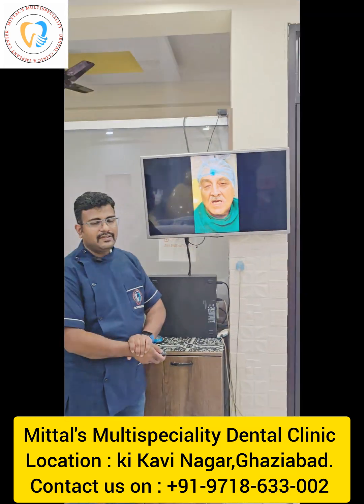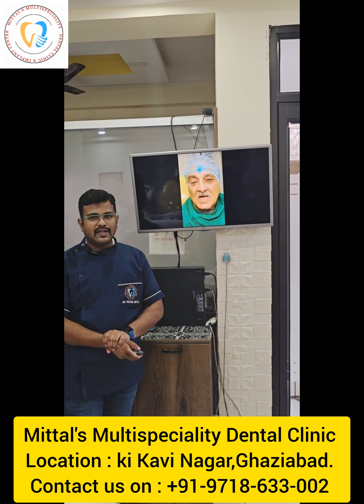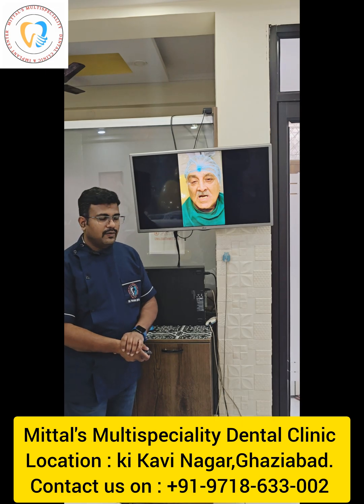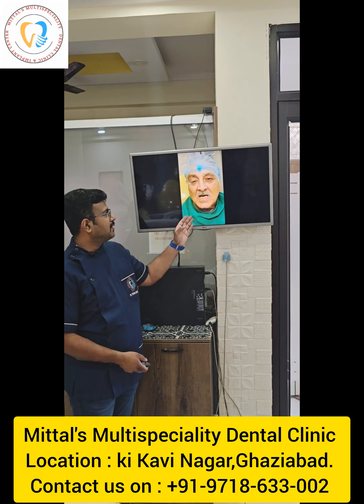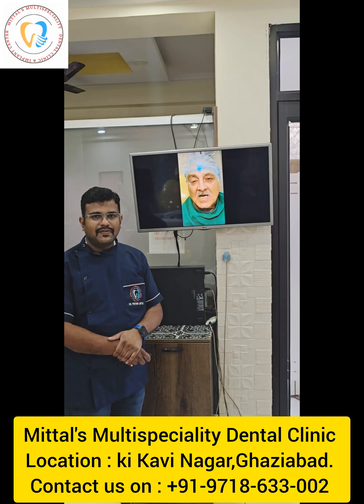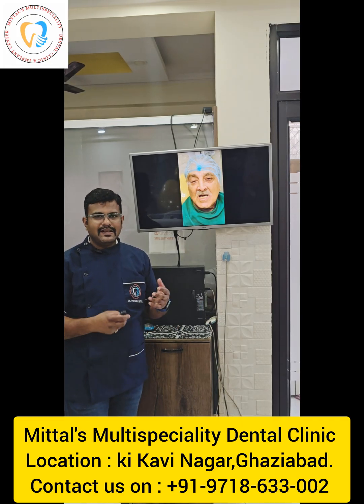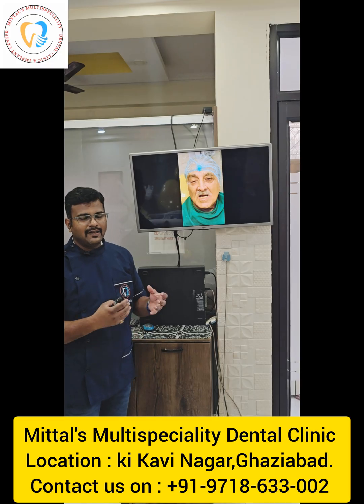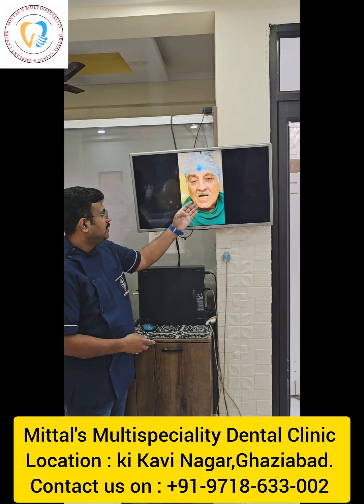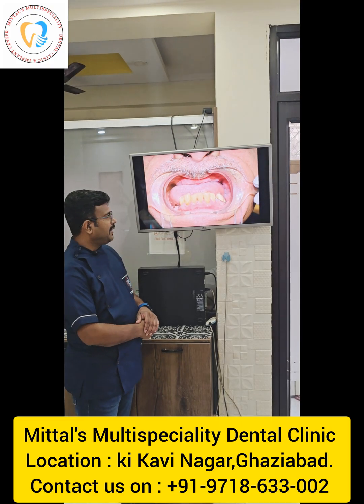So as I always say, diagnosis is the first thing we should do before starting any case. So that way we have taken a picture, a sad man who cannot eat the food as his family is eating. He wished something could be given so that he can eat with the family, sitting at the same table. Then we have the intraoral pic.